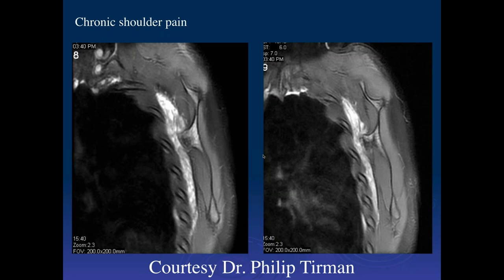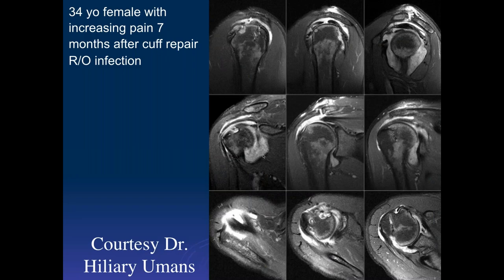They might have missed the boat. Yeah. Contrast would have probably helped there, right? Well, I mean, the question was whether contrast would help. To me, I can see the synovial thickening here. The contrast would show the synovial thickening, but I think you can see it very nicely without contrast. But if you think this is too subtle and you want something that's really bright, then contrast could be helpful. Now, personally, I don't think it would be really that helpful here.